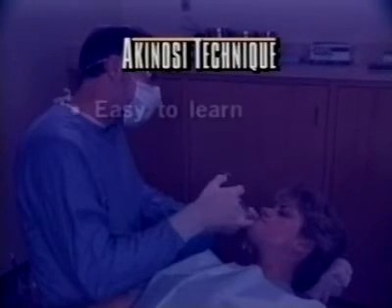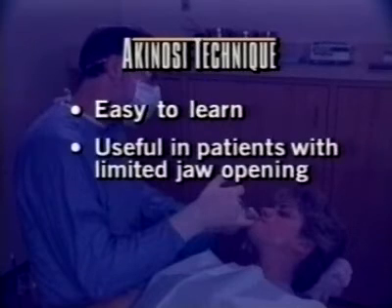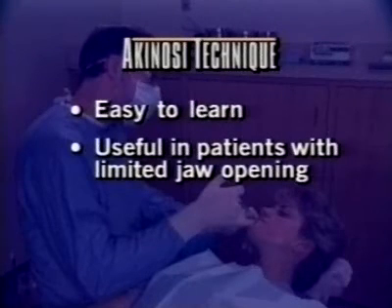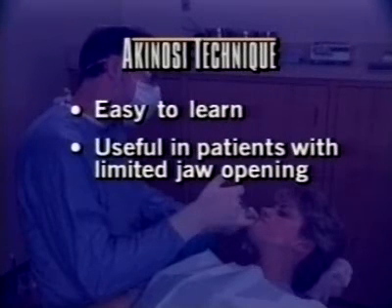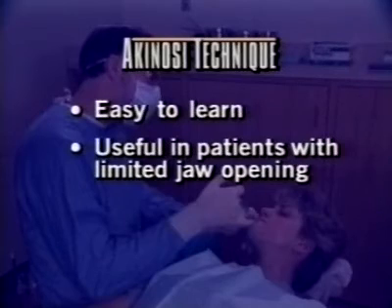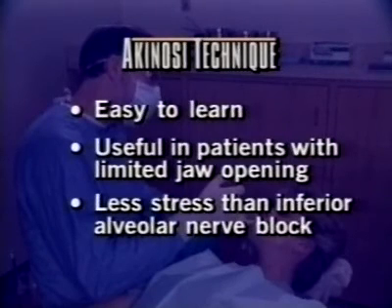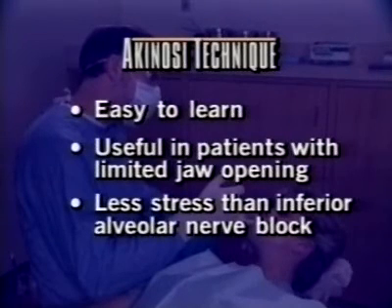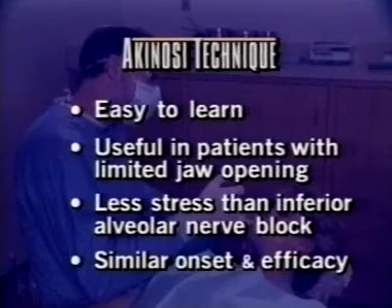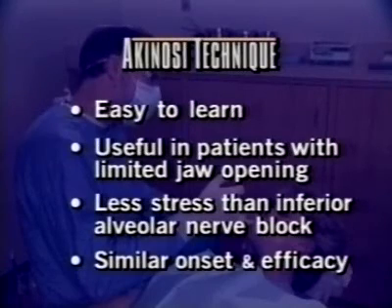it is technically easy to learn and of great advantage in the patient with limited jaw opening. It is also perceived by some patients as less stressful than the standard inferior alveolar nerve block, yet comparable in onset time and anesthetic efficacy.